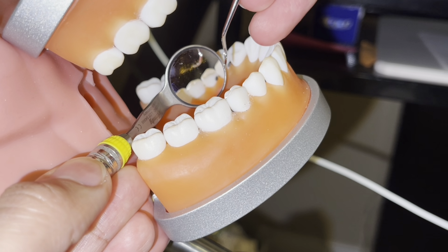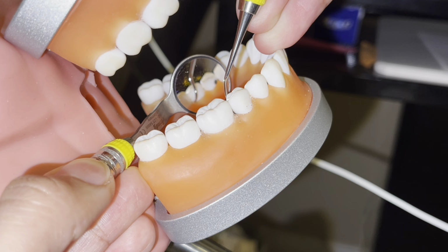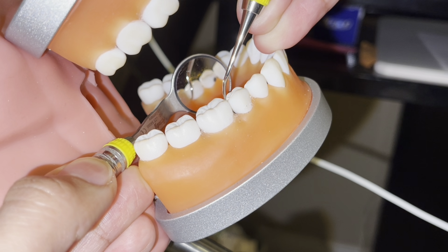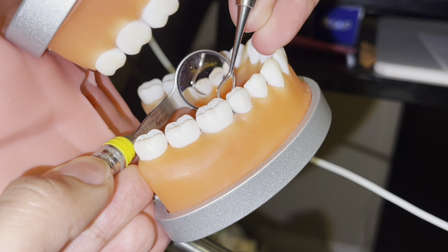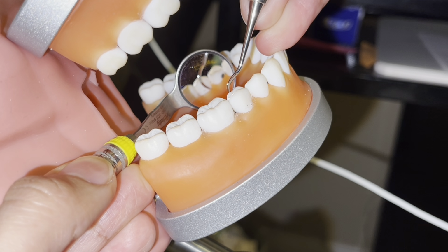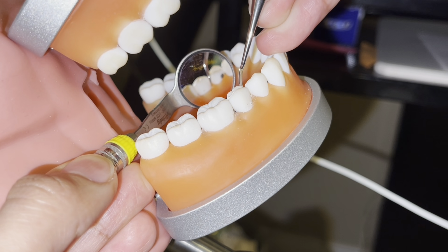For tooth number 29, once more, an oblique stroke, side to side, pivot roll, side to side, and then oblique lateral strokes, up, down. Turn your instrument halfway, activate vertical strokes, up, down, side to side, pivot roll, side to side, pivot roll, side to side.